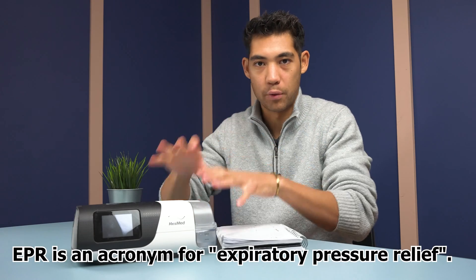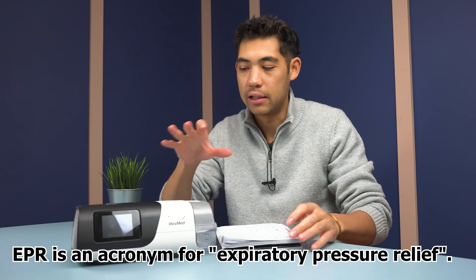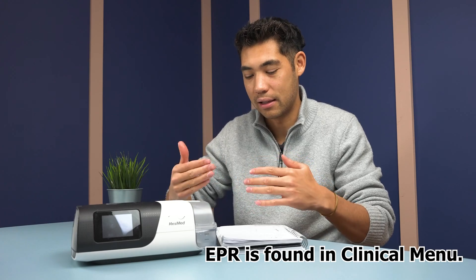EPR is a feature on ResMed machines that reduces pressure when you exhale. Different machines have different names for exhale relief — it might be called exhale relief, breathe easy, or some similar name referring to breathing comfortably when exhaling.